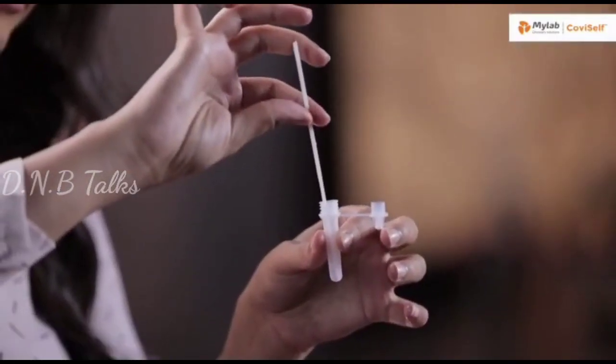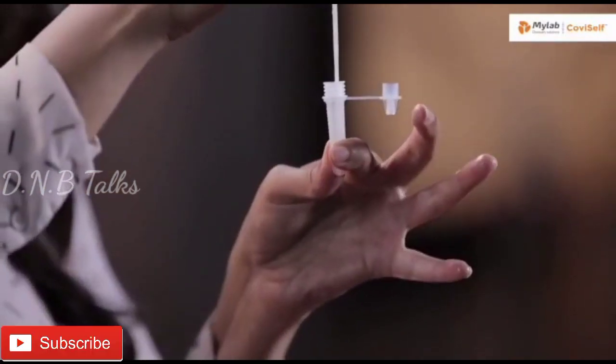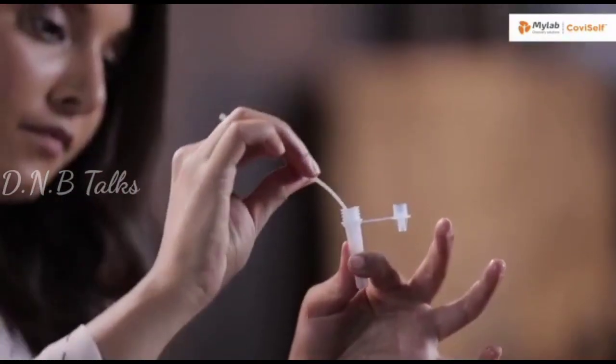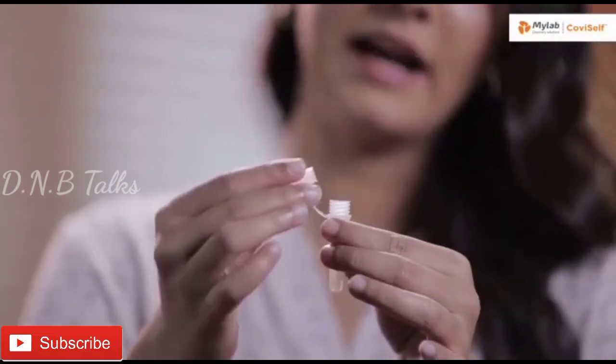Dip the nasal swab sample in the pre-filled extraction tube. Pinch the tube at the bottom and swirl the nasal swab well. Make sure the swab is immersed in the liquid. Find the break point and break the swab. Cover the tube with the nozzle cap and tighten it.